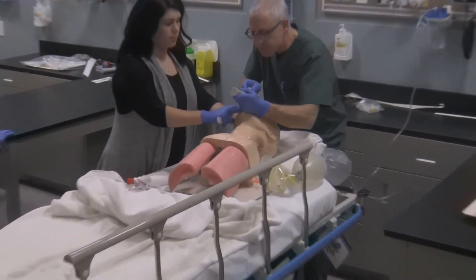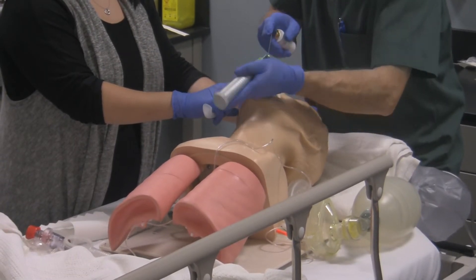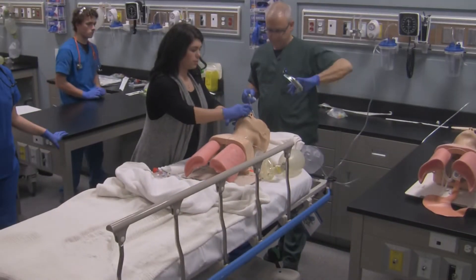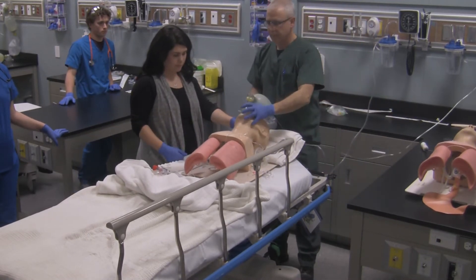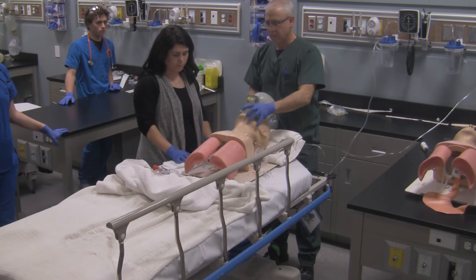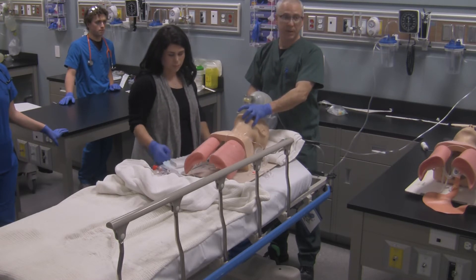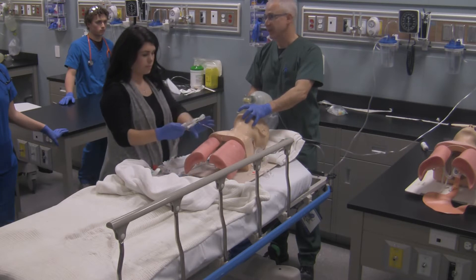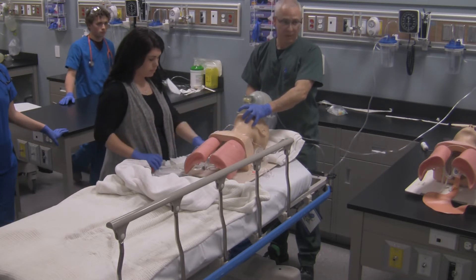I spray — up to ten sprays. So it won't need this anymore. I'm going to resume ventilation again. One to two minutes goes by. Remember, you only apply the local anesthetic if you need to, and only do it one way or the other — you don't have to do both.